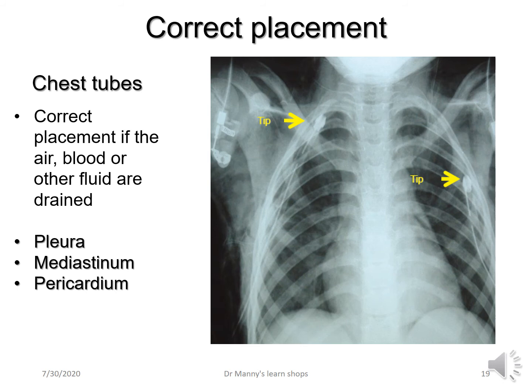And on the chest X-ray you should see the tip. Remember, all invasive tubes are radio-opaque. You can see on this X-ray, this infant has two tubes, bilateral, probably because of bilateral pneumothorax. If you look at the skin, he's got subcutaneous emphysema in the peripheries. So that's probably the reason why it was inserted. And what should have happened is the air should be draining out into the underwater seal drainage collection chamber.